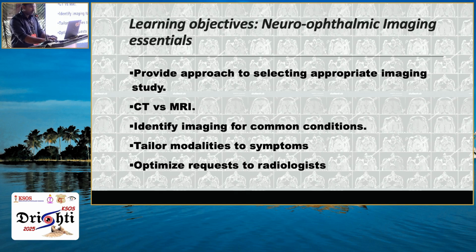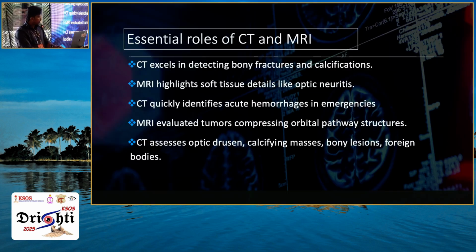So our goal here is to learn how to select a proper modality, CT or MRI, and learn key imaging findings of common conditions and tailor the imaging requests to clinical symptoms so the radiologist can support your diagnosis. Essential roles of the CT and MRI.